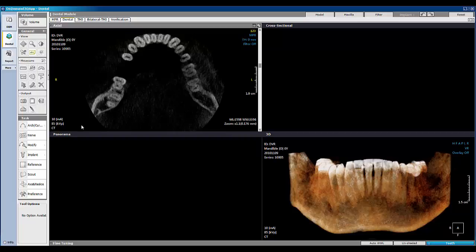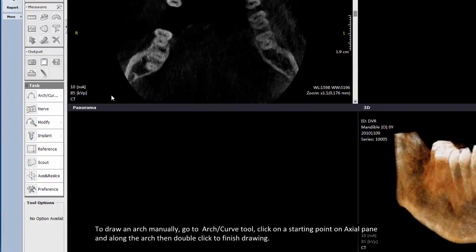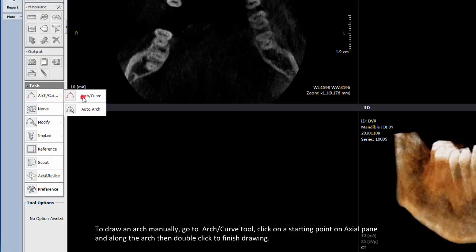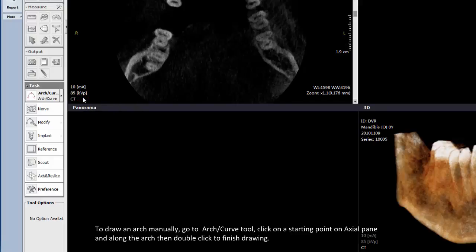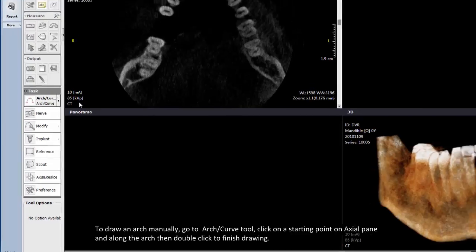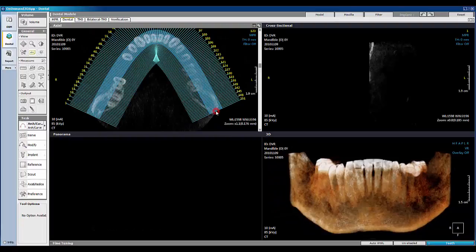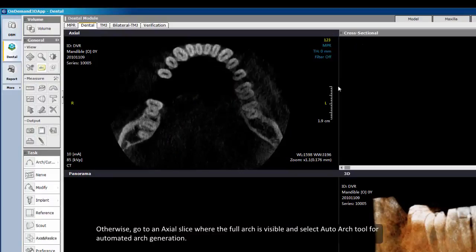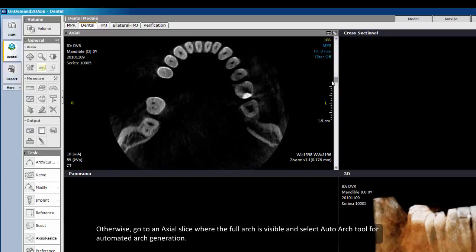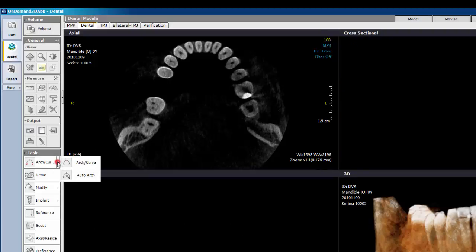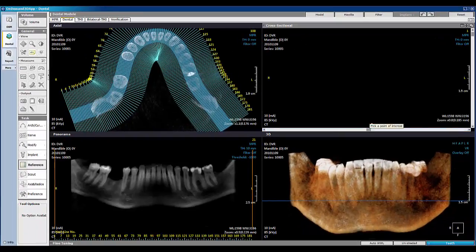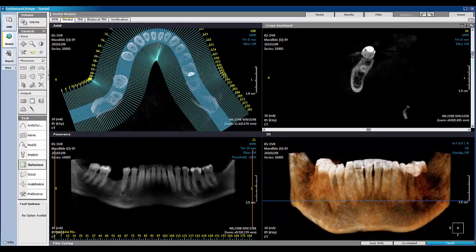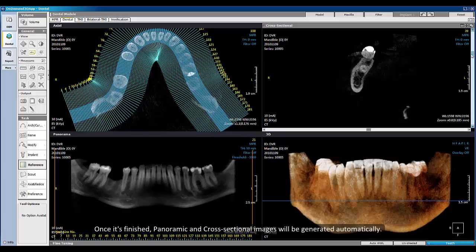There are several task tools in the Dental tab for implant planning. First, start by drawing an arc to obtain a cross-sectional and panorama image. To draw an arc manually, go to the Arc or Curve tool, click on a starting point on the axial pane and along the arc, then double-click to finish drawing. Otherwise, go to an axial slice where the full arc is visible and select the Auto-Arc tool for automated arc generation. Once finished, panoramic and cross-sectional images will be generated automatically.